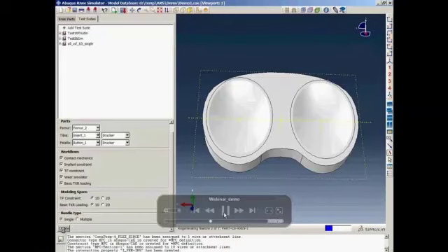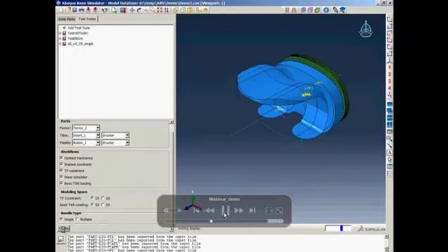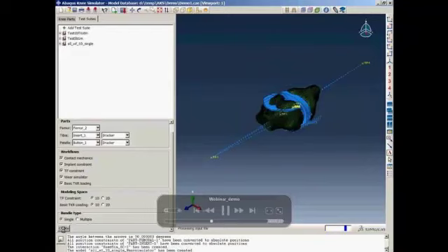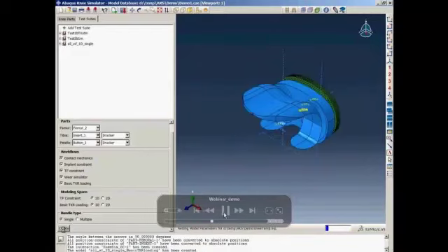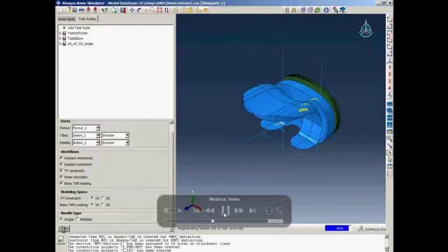So this is the real time. I didn't speed up anything. You see how quickly these models are generated, and the implants are assembled and positioned in the assembly along with all the soft tissue and hard tissue provided for each workflow. And at the bottom, you see all the features have been generated for each workflow.